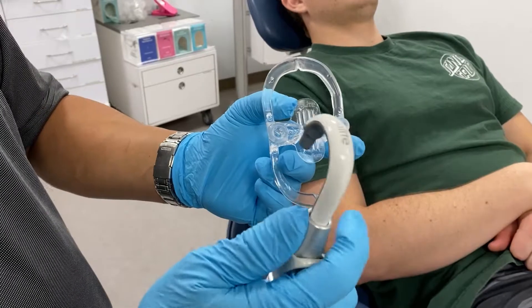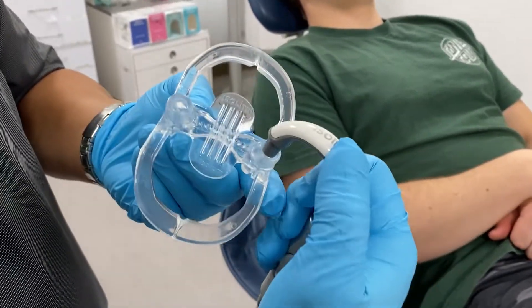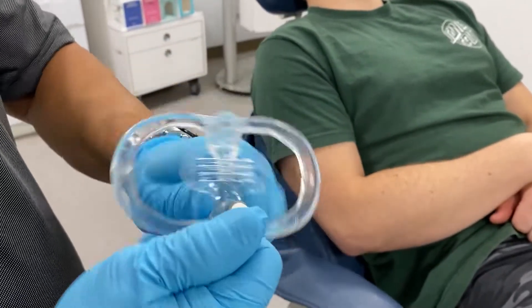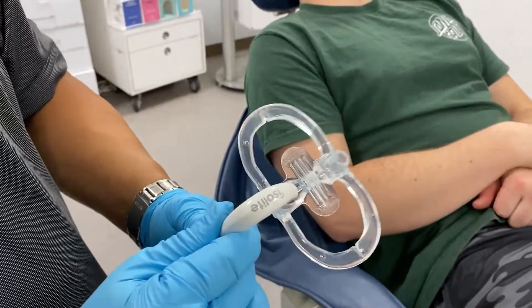Connecting it to your HVE is as simple as taking the adapter, connecting it to the HVE hose, and then connecting that onto either the left side or right side of the mouthpiece. This can be done external to the patient or after the mouthpiece has been placed inside the patient's mouth.